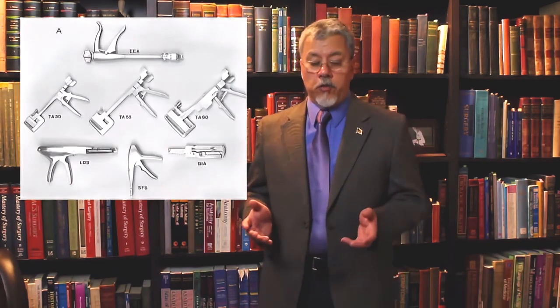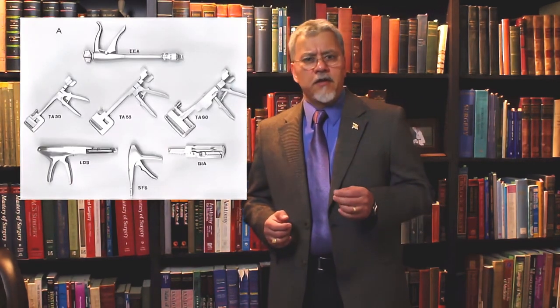Eventually, American manufacturers started developing these products. In the 1960s, these products were reusable. In the 1970s, disposable surgical staplers started to appear. Disposability ensures functionality and guarantees sterility.